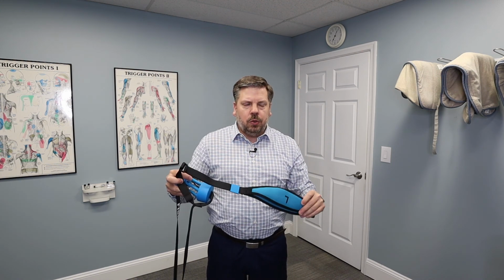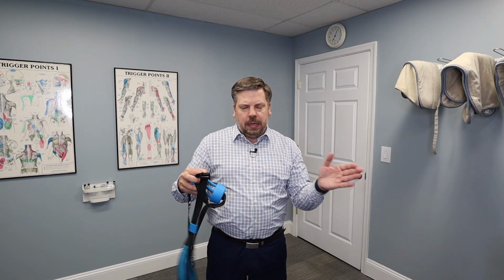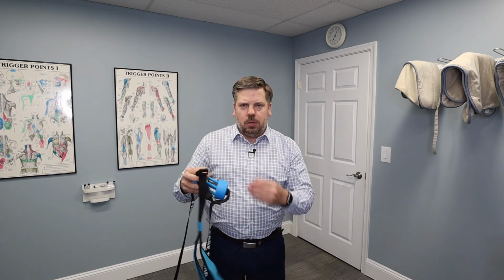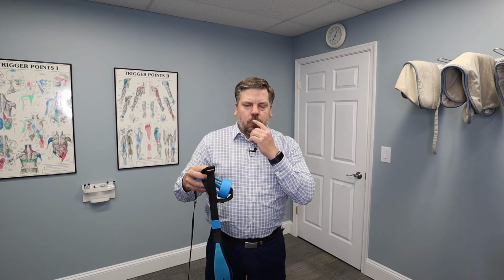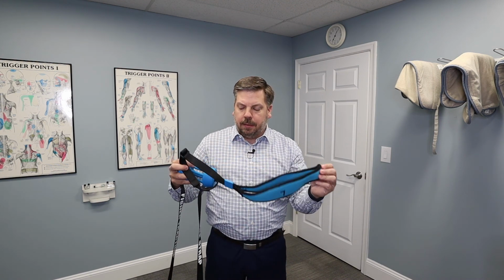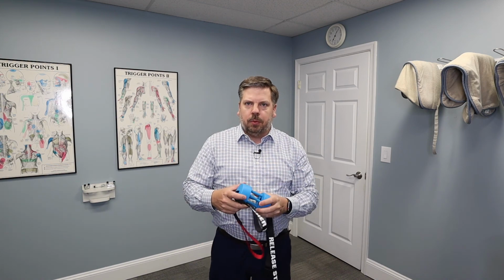And basically when you lay down with this, as far as how to gauge how far away you are from the door, when you fully stretch this out, it should be roughly in between your mouth and your chin, this end part. So I'll show you that as far as the setup goes. What we're going to do, again, is lock this in the door and then I'll get you set up and we'll show you that.